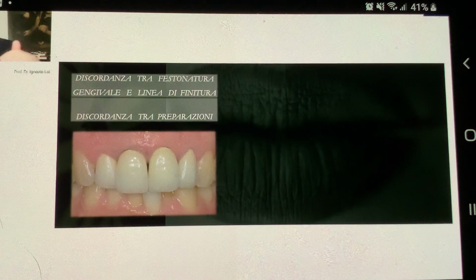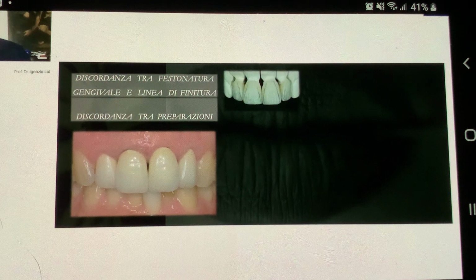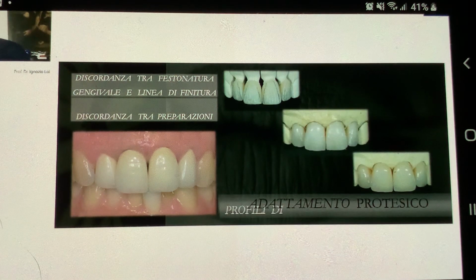So I will have a vertical preparation, I will put the provisional teeth realigned, which will lead the tissues to reposition in the correct area, and then I will create a restoration through crowns that have a finish line and symmetric volumes in the central ones and the lateral ones.